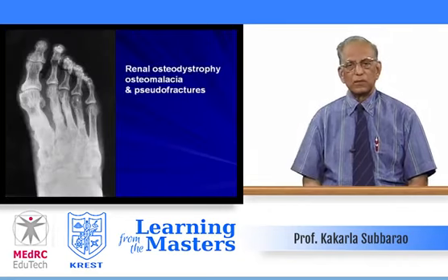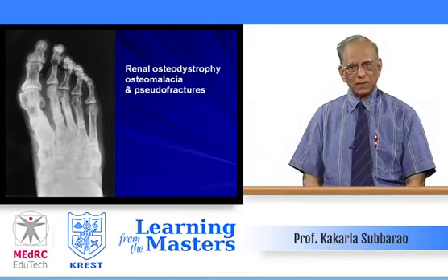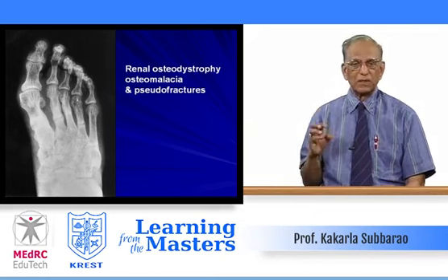And then there is what is called renal osteodystrophy. Chronic renal disease is not uncommon. In that, you get both osteomalacia and pseudofractures. Again, look at the bones of the foot. There is increased density. See, renal osteodystrophy is a syndrome.